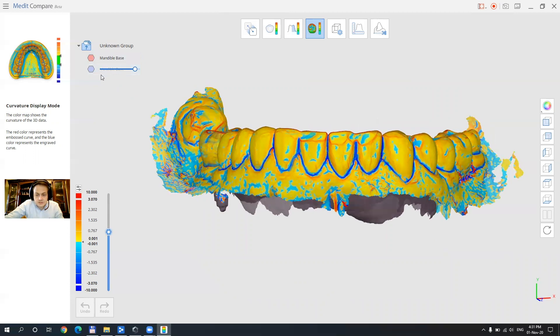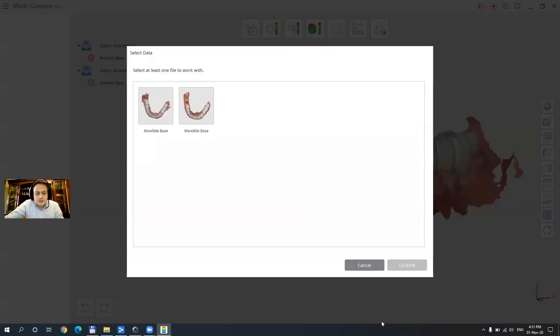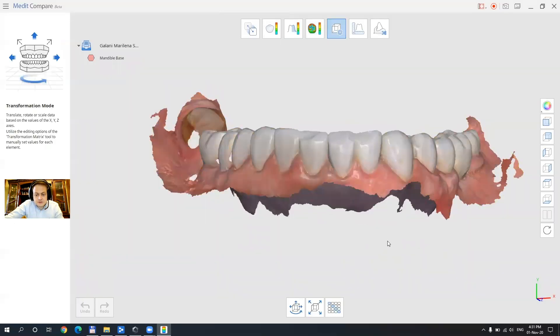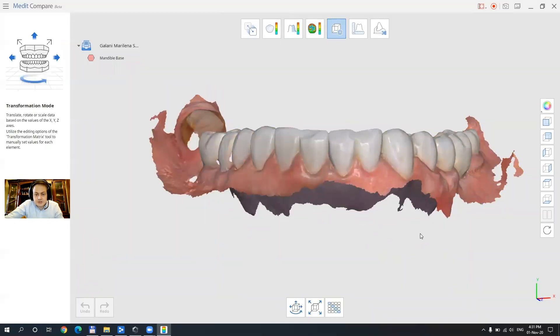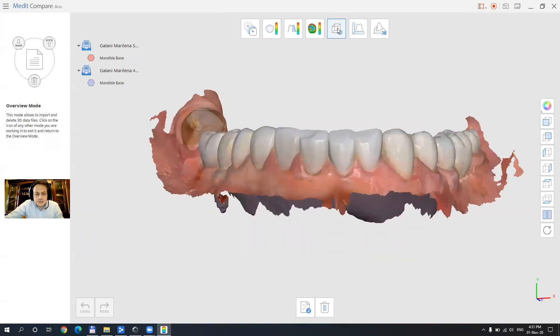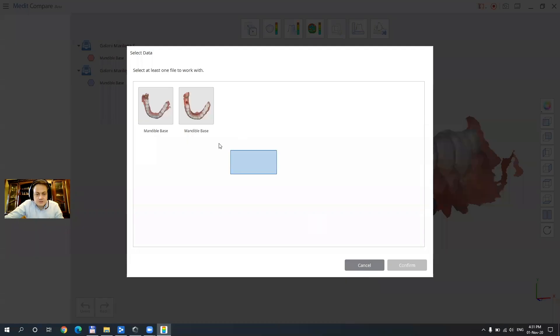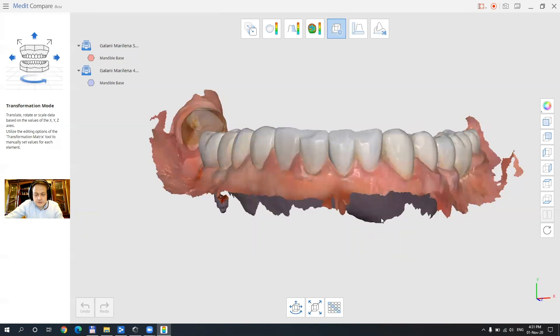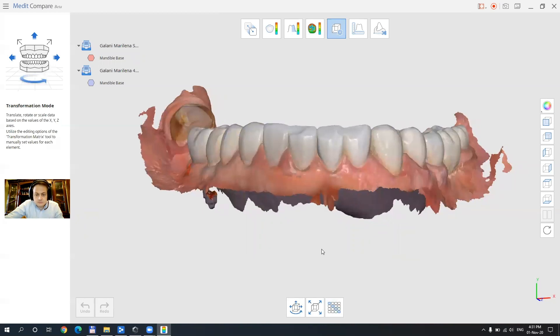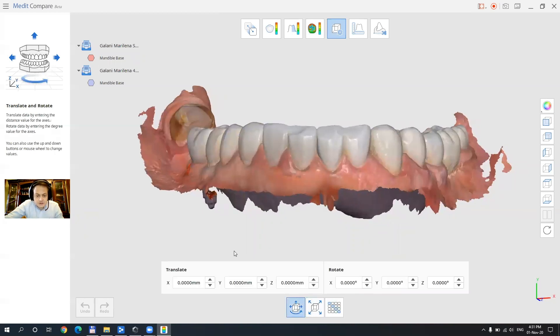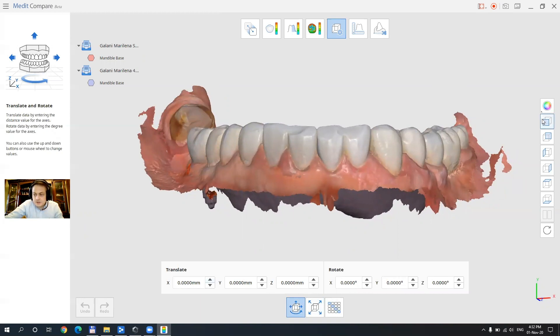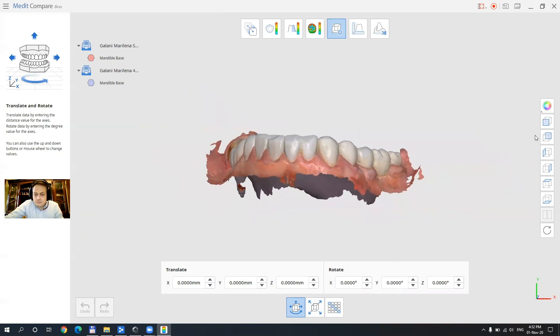modify the transparency of objects. Next function next function is about positioning objects in the three-dimensional space. Let's see how we can move them together or we can translate them in any direction we need compared to the main x y z axis.